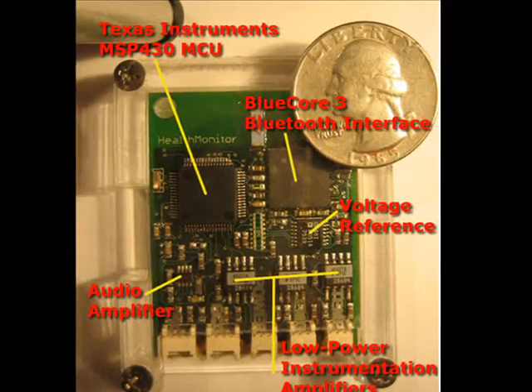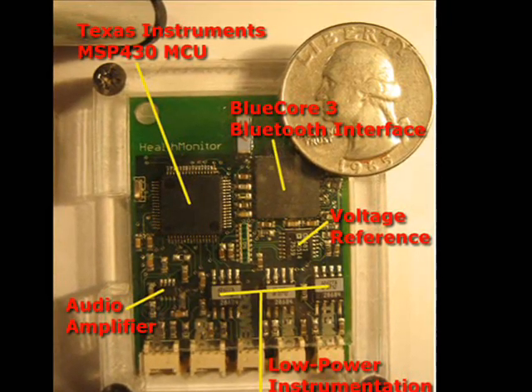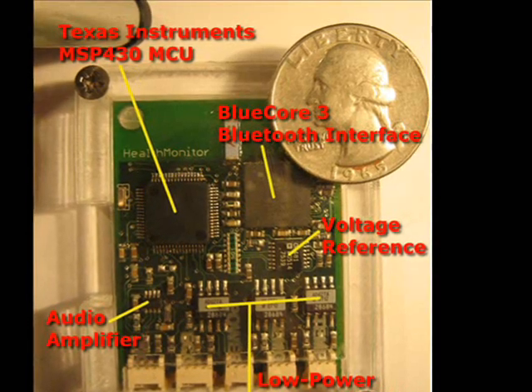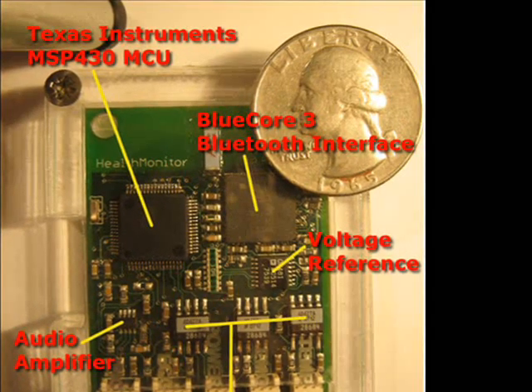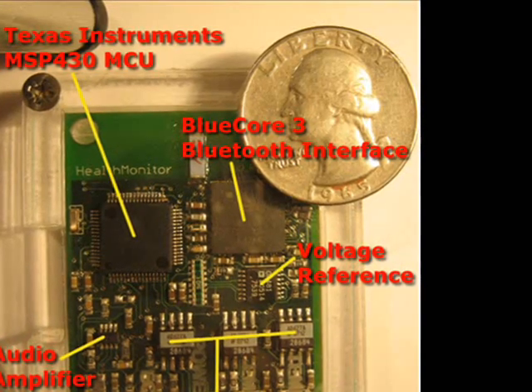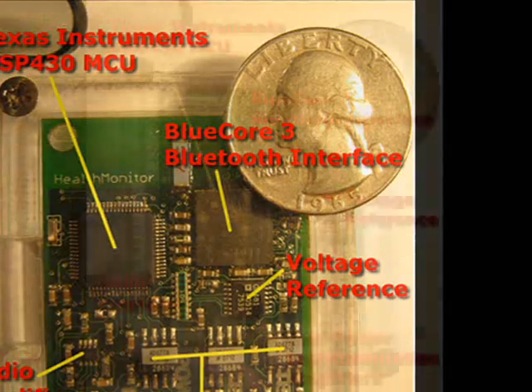The Bluetooth chipset we are using is the BlueCore 3 by CSR. It's a very powerful chipset that includes most of the electronics required for Bluetooth implementation internally. In conjunction with the user's cell phone, it provides our health monitor with internet access through dial-up networking, the ability to remotely monitor someone's breathing sounds when used in a hands-free configuration, as well as a means of synchronizing recorded data with a PC through object exchange.